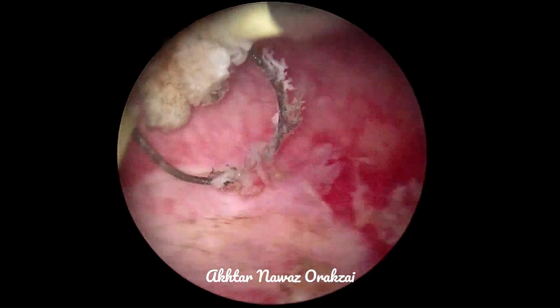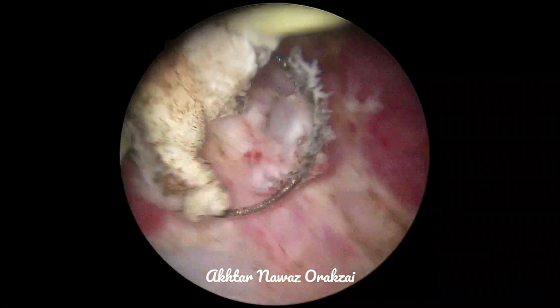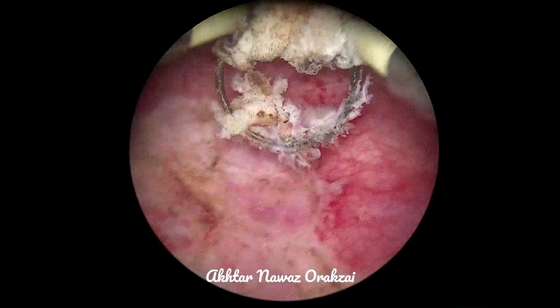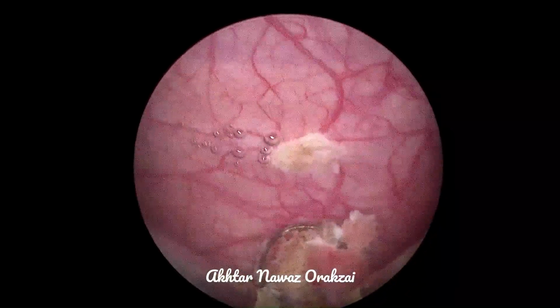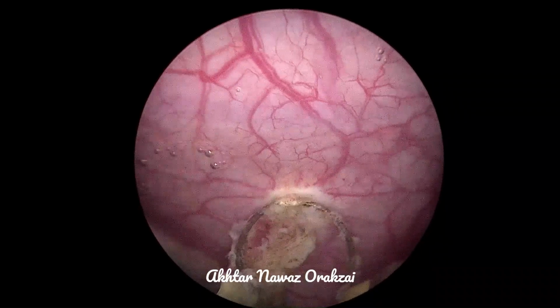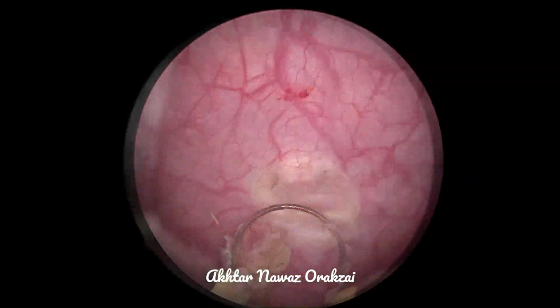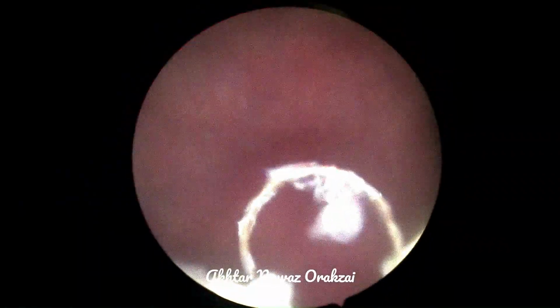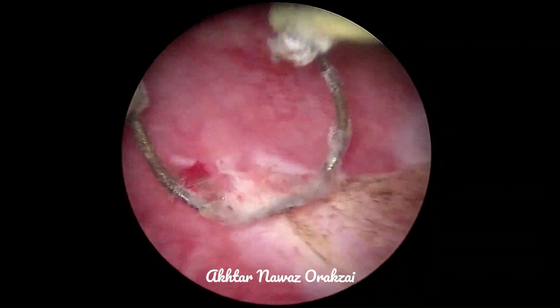We have resected almost all of the papillary growths, and if there is a suspicion that there is no muscle in the specimen, we will go for resection and sampling of the muscular tissue or deeper tissue after removing all this resected tissue, and we will send them separately so that the histopathologist can easily tell us whether there is any involvement of the muscle or not.